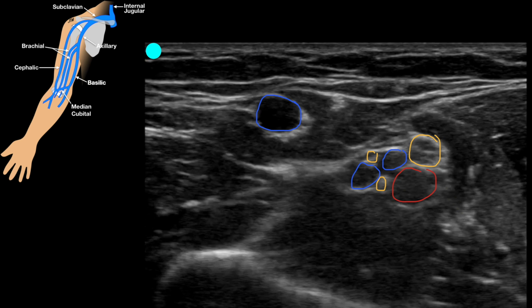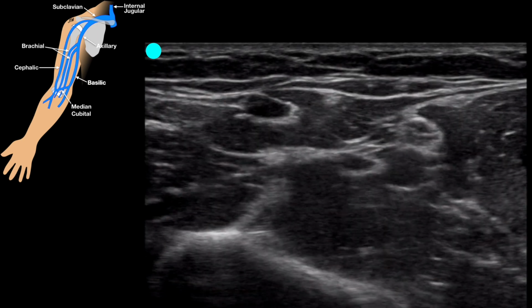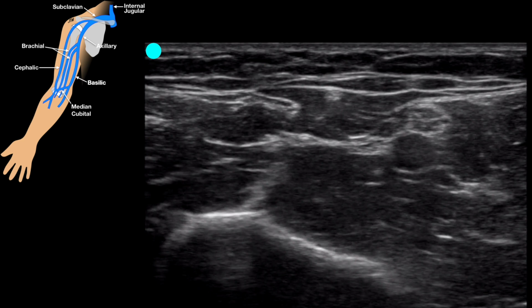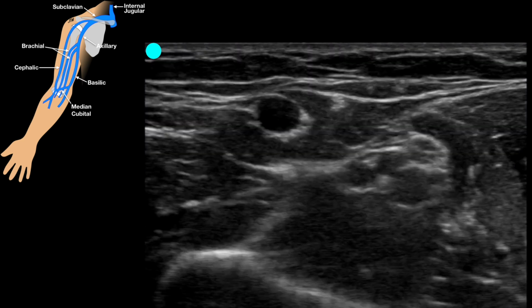We will see the deep brachials again here, and we'll see them flipped on a different extremity. So we can see those veins collapsing. We can see that in this image, we would prefer to go after the basilic, which is right here, because it's away from all these other structures. But if that's not visible, we may have to go after a deep brachial, and that gets a little more fishy working around those nerves and that artery. But let's see an example of maybe one of those we would pick.